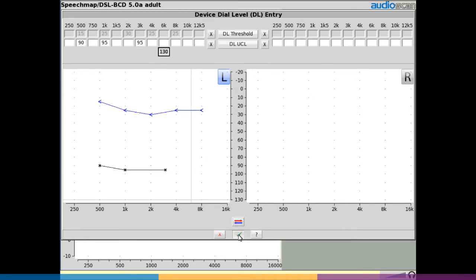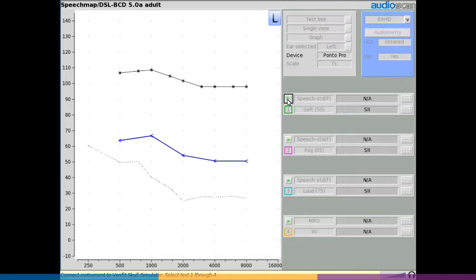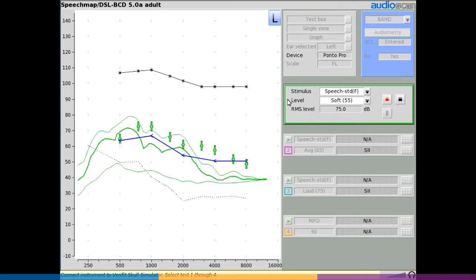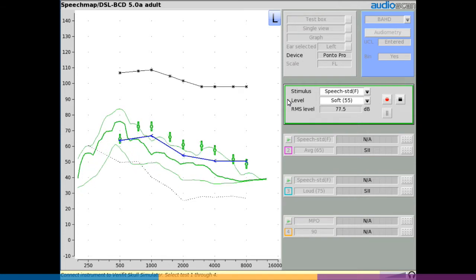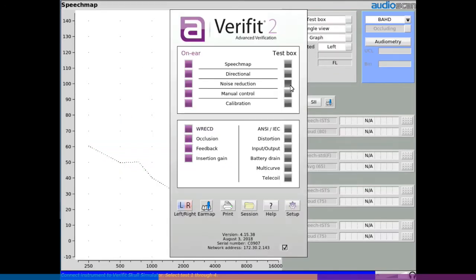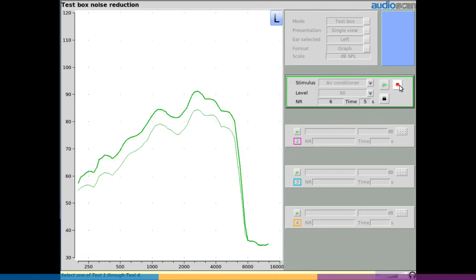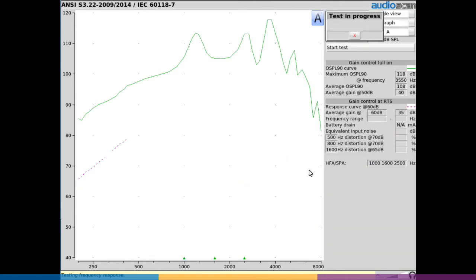Select continue once audiometric information has been entered. Follow your typical verification procedure, selecting the desired test signals from the provided test drop-down menus and adjusting the BAHD as desired to match the provided force level targets. In addition to speech map testing, you can test features like noise reduction or directional in the test box. Tests run as they would with acoustically coupled instruments, but the display on screen is in force level rather than dB SPL. Likewise, you may run an ANSI test, and the results must be interpreted in force level to compare with manufacturer's data.